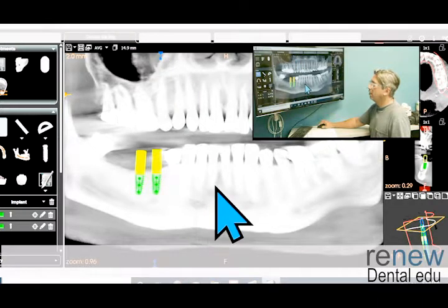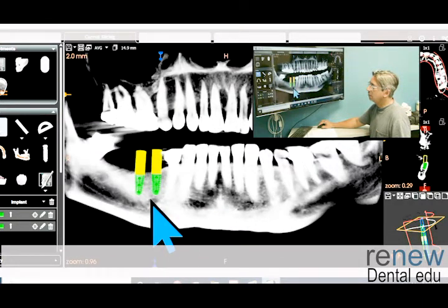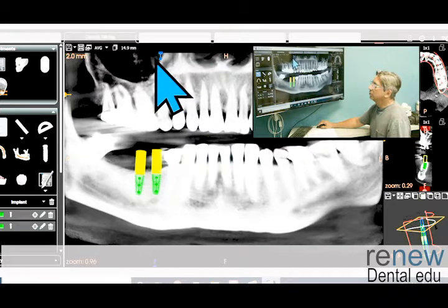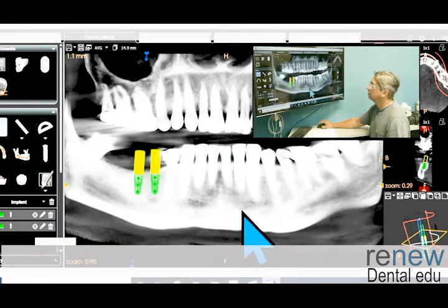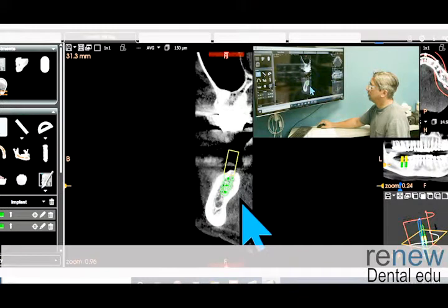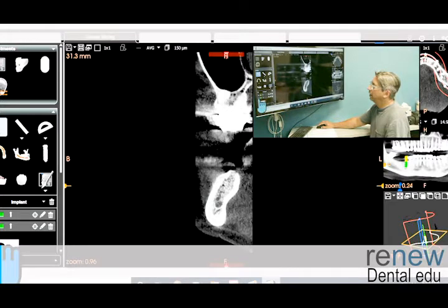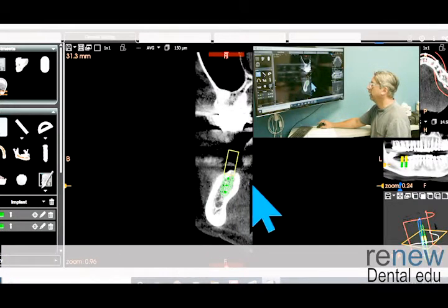If you only have a pano, you can see that. Now that nerve shows up right there. It looks like you're coming right on top of the foramen. You can see the nerve coming through here. So you got a little bit more room on the molar site. So let's look at that. And here I'll just click and go straight to it. Here's what that looks like. So we've got nice bone here. You got the nerve going through. You got a lot of cortical wall. Unfortunately, it's not as wide as you want. Maybe you want a 5mm implant here, but a 4.2, once again, this is a 4.2 by 8.5 that's put in there.